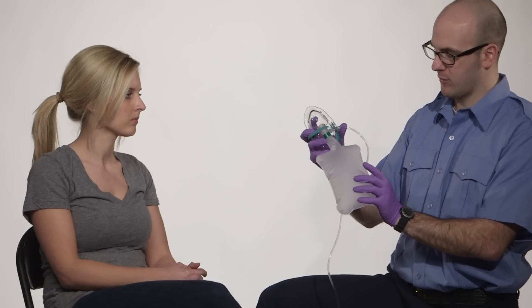Cover this. Make sure my bag fills appropriately. Now that I've got that done.